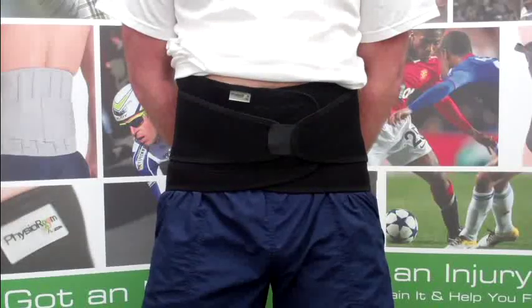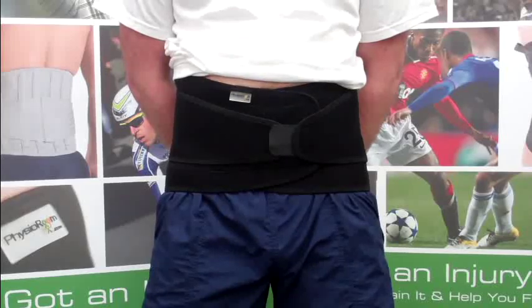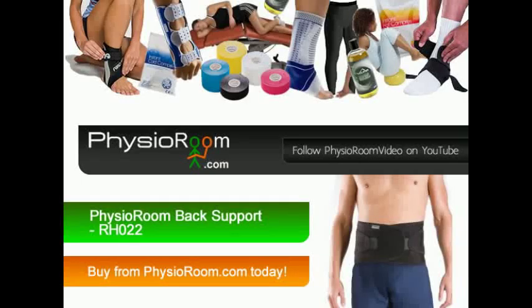This back support is available in sizes small to extra extra large. So, order your PhysioRoom.com Elite Back Support today!